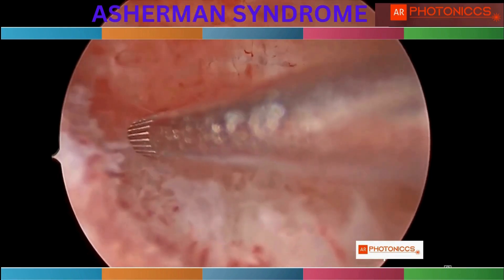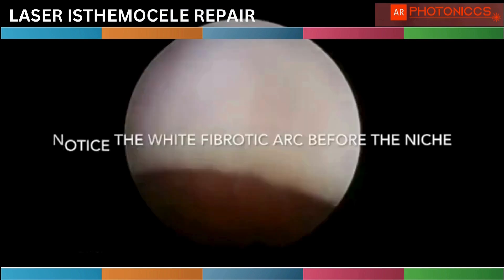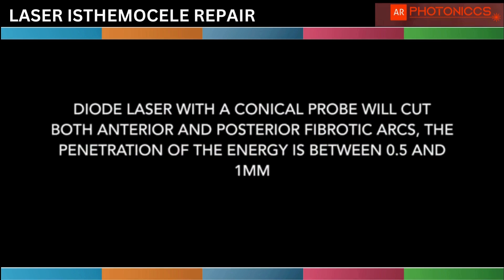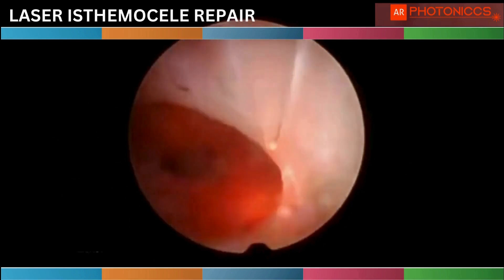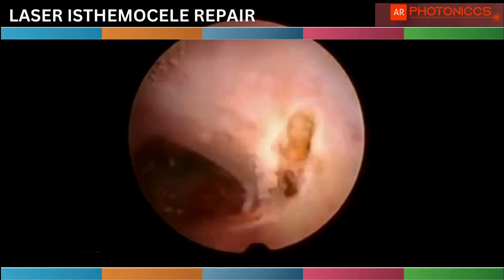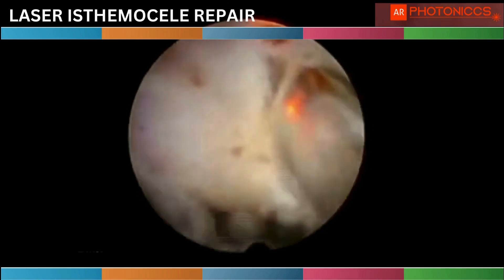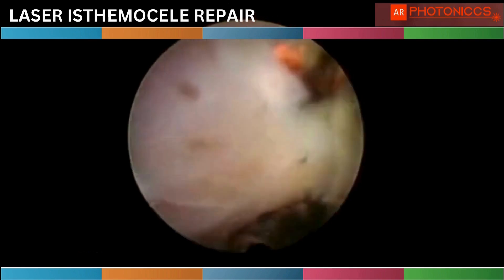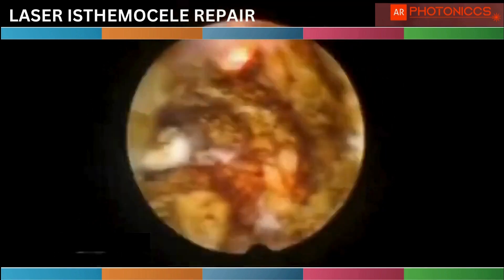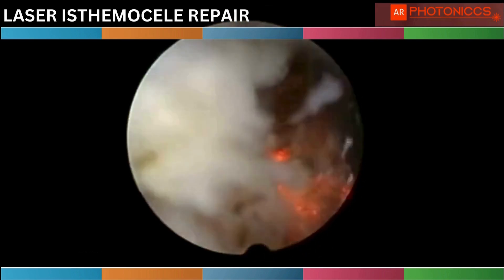For three settings, different endometrial thickness will improve and endometrial quality will improve, and you can then proceed with embryo transfer. The next case is isthmocele — for early grade one, grade two, or early stages, you can do isthmocele repair. Extensive debridement: use the laser to cut the fibrous tissue, all inflammatory tissue, and all pathological tissue. Just do the debridement, excise all the tissue at the previous cesarean scar — that is called the niche — and just excise all the area, coagulate the bleeding, and resurface it. It is a very day-care procedure.